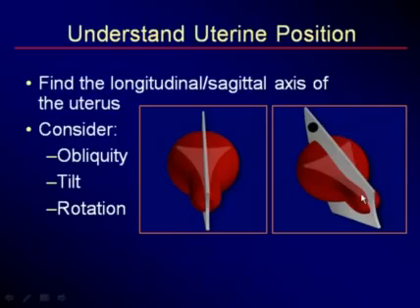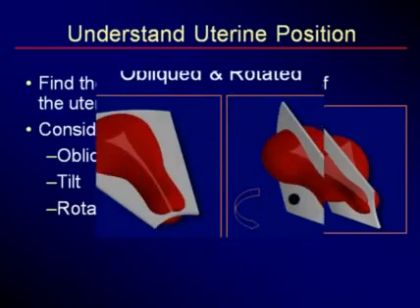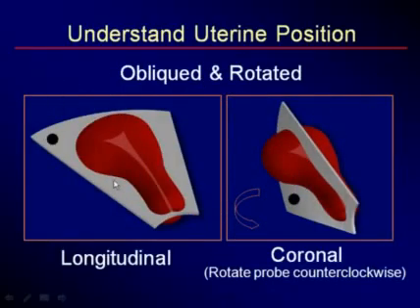We would have followed it through the cervix into the endometrial cavity, and we realize that the longest length of this, the longest axis, is tilted from midline. It can also be obliqued and rotated. Sometimes the uterus is obliqued, so to get its longest axis, we have to actually rotate the beam.